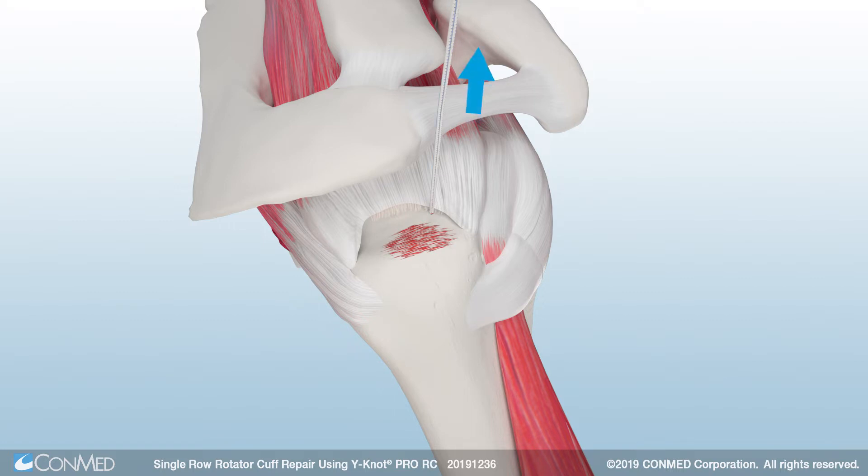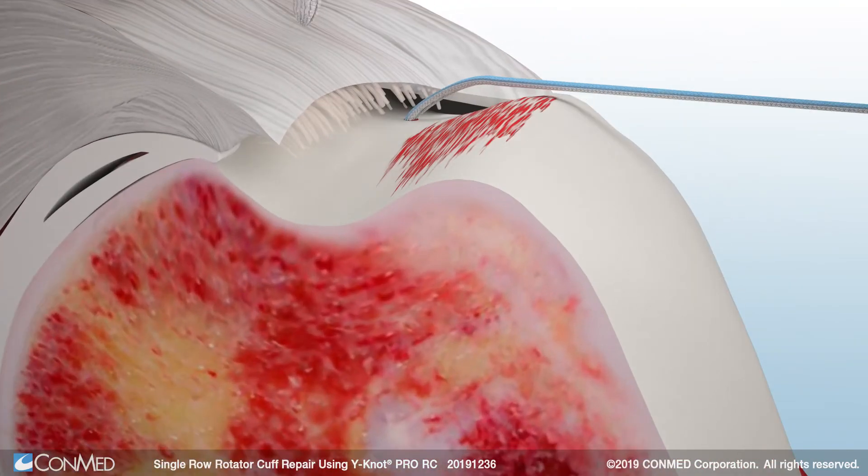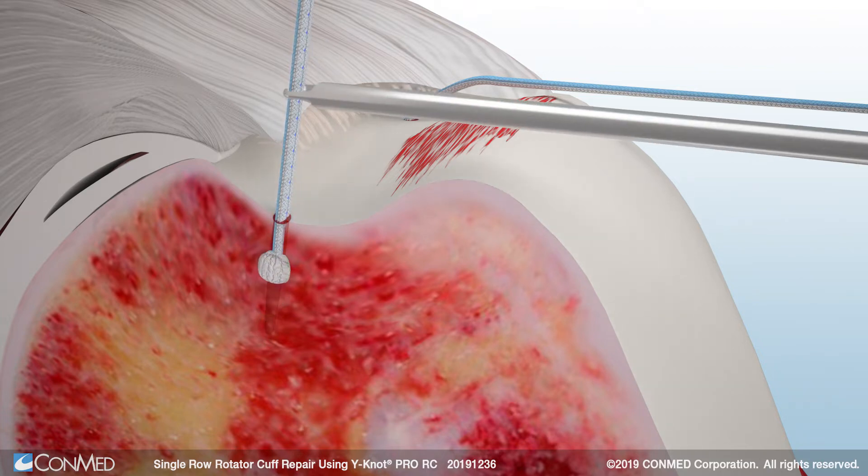Then, pull back on all the suture limbs to confirm anchor fixation. Next, gently mallet another Y-Knot Pro RC into the posterior insertion site found on the footprint. Remove the anchor driver and pull back on all the suture limbs to set the anchor.